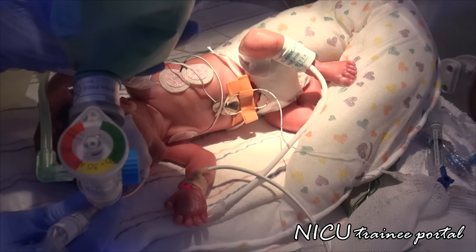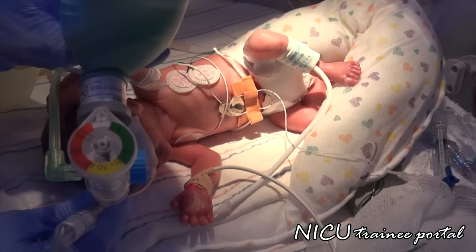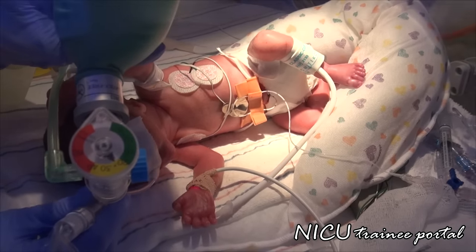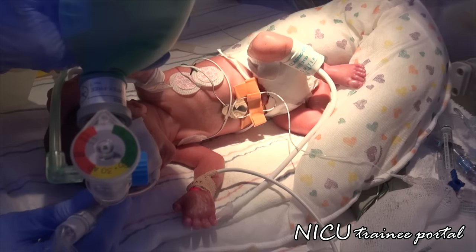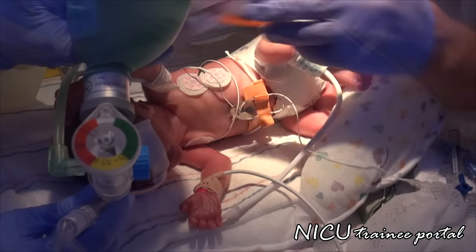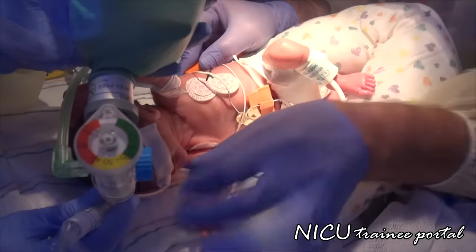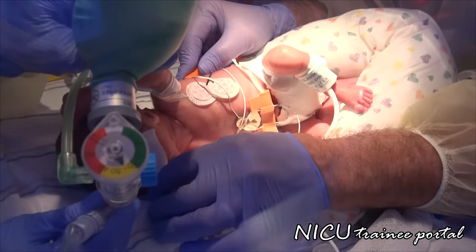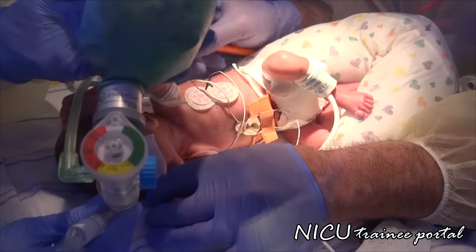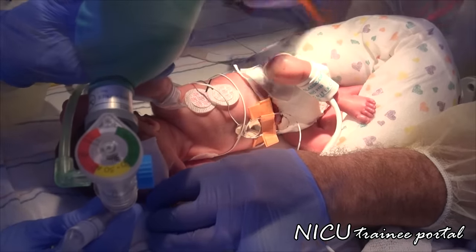The provider listens to confirm tube placement, then notes bagging parameters of 25 over 5, and the team confirms the baby is stable and ready to proceed.